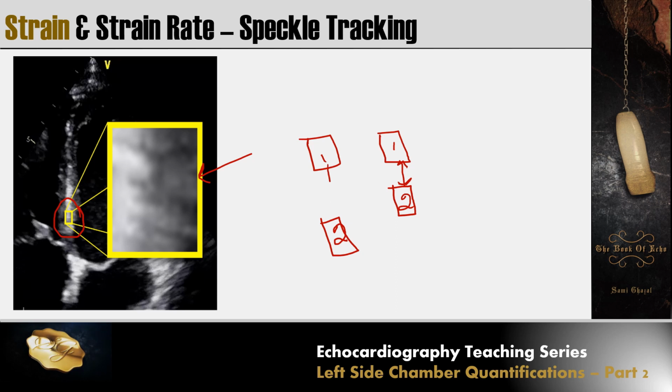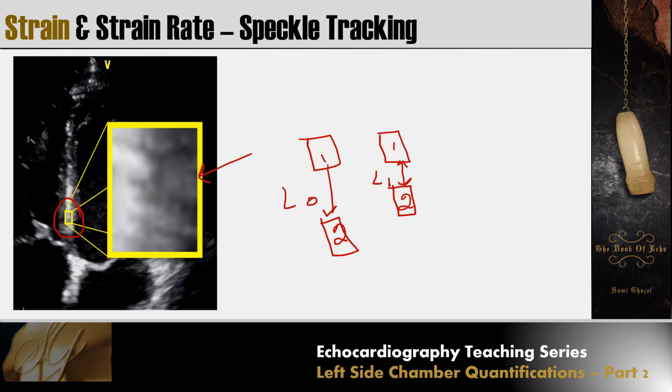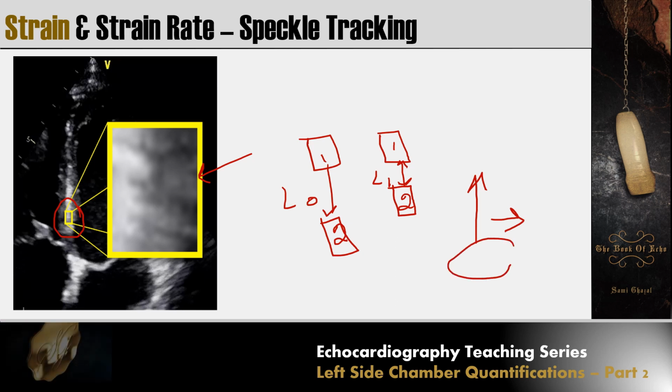From this equation, here is L0, here is L1, you can easily calculate strain and strain rate. This technology is not angle dependent. Therefore, you can measure longitudinal strain, radial strain, circumferential strain, and from this also you can measure twist. And we will see this in the coming slides.